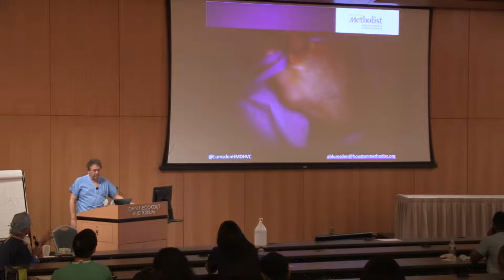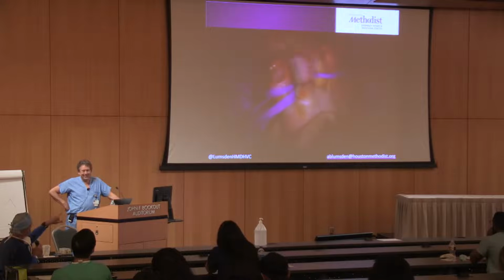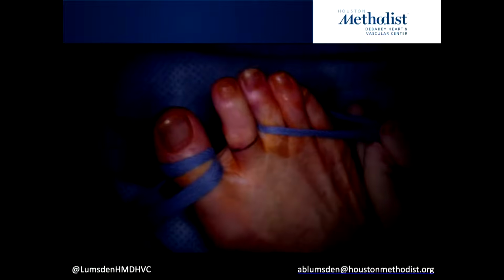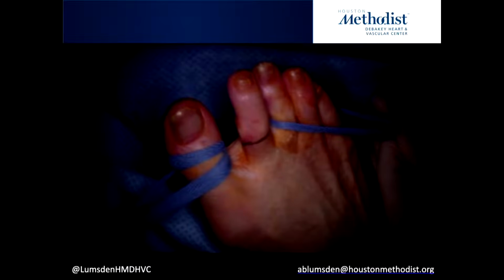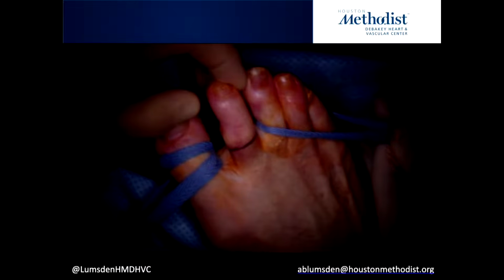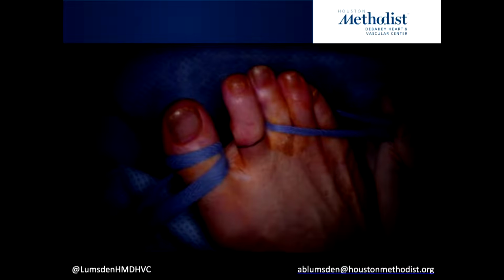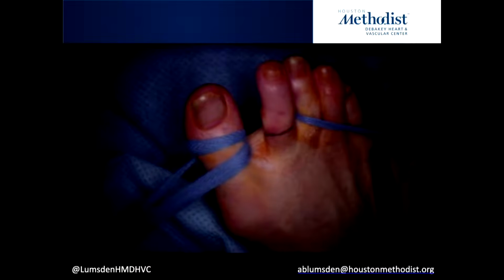Toe amputation, for the most part, we use, I don't know if this shows it or not, but this is not a bad technique. It's a little dark, but using those tourniquets, using the loops on the back end of lap sponges is a good way to separate the toes and give yourself a little more room. We don't usually take off normal toes like this one, but sometimes you have to.